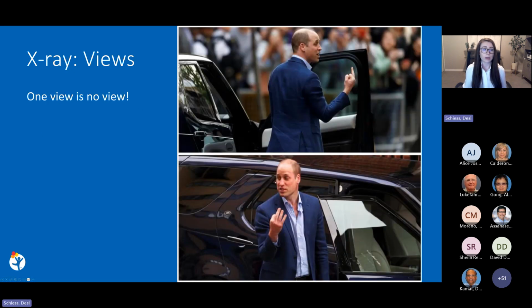That case was an example of an imaging principle that we like to call one view is no view, and this set of images is another excellent example of that.